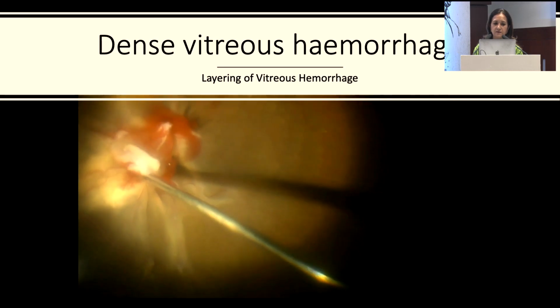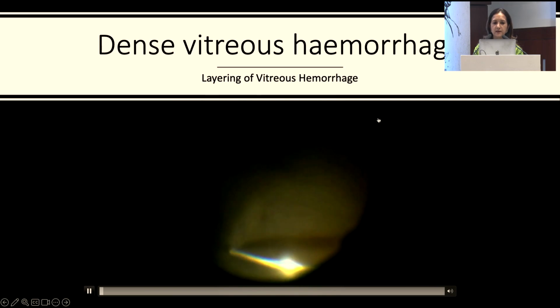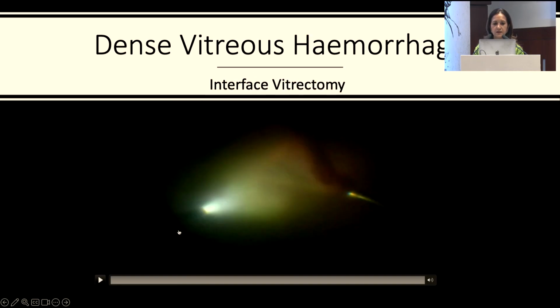I only cut it when I see the pegs. So this is another way. Then there is another way of dealing with dense vitreous hemorrhage that you have.